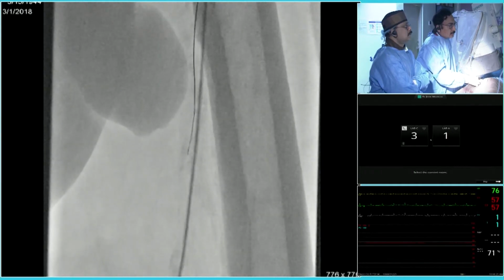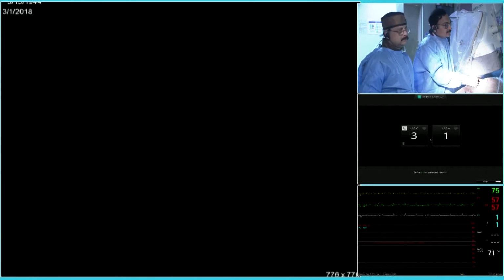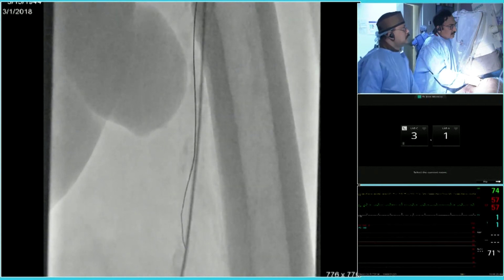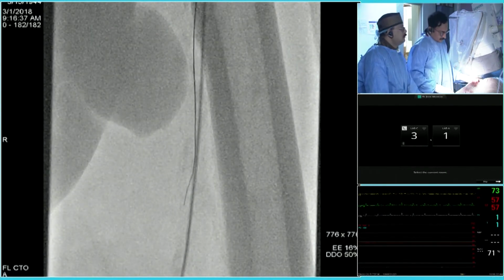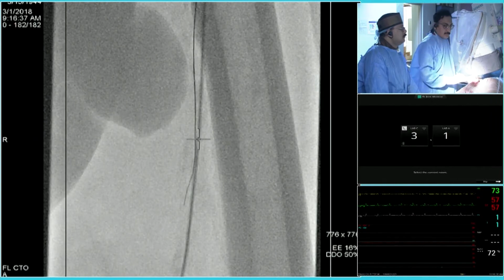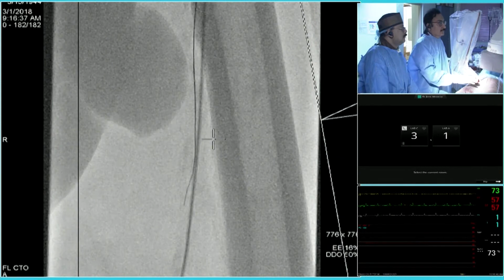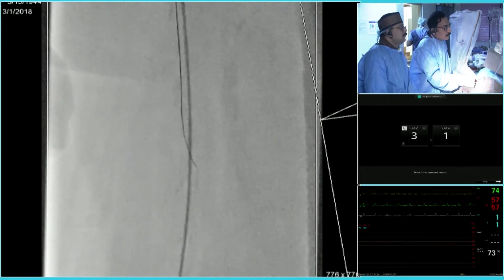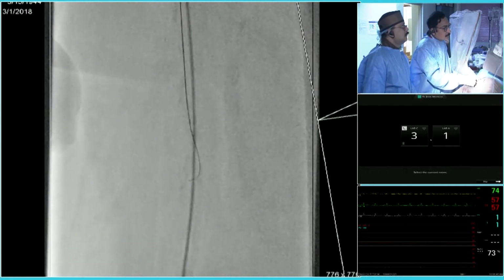I don't know what the opinion of the panel here is, but over 20, 25 years of doing this work, I've always been struck that the minute you get into the false lumen, it doesn't matter what you use afterwards, drug-eluting balloon, drug-eluting stent, the risk of restenosis is extraordinarily high. The minute you have a significant segment of false lumen, you are pretty much almost guaranteed a restenosis that is pretty vicious.